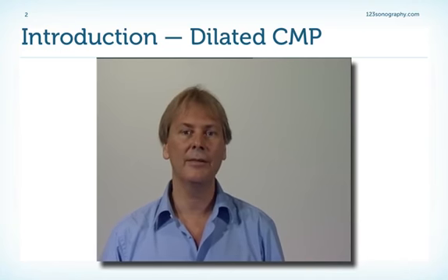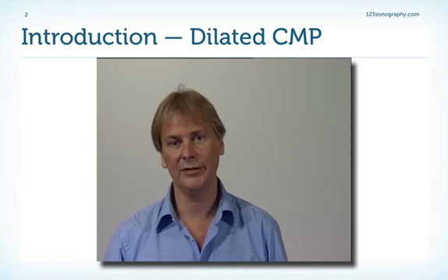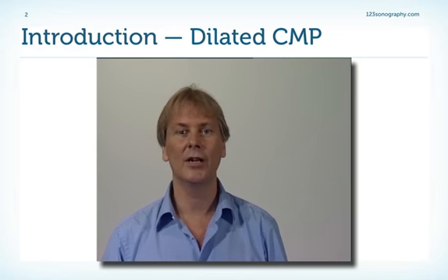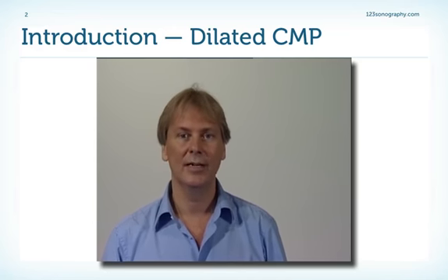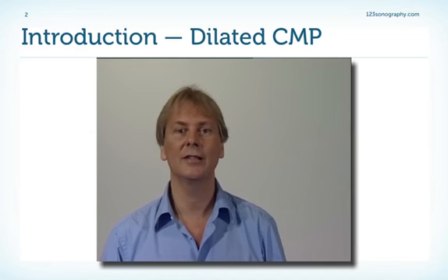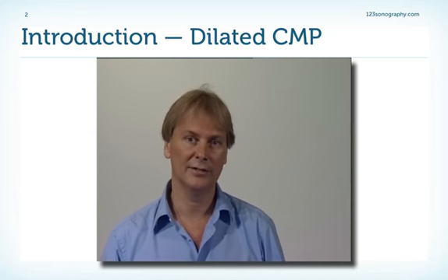Echocardiography is probably the primary imaging tool to assess patients with dilated cardiomyopathy. With help of echo, we can not only establish the diagnosis, we can also assess the prognosis, the hemodynamic sequels, and very often we can even find out what the cause of dilatation and of reduced left ventricular function is.